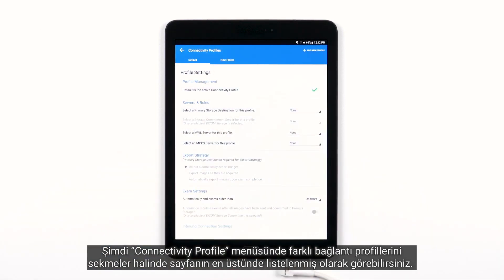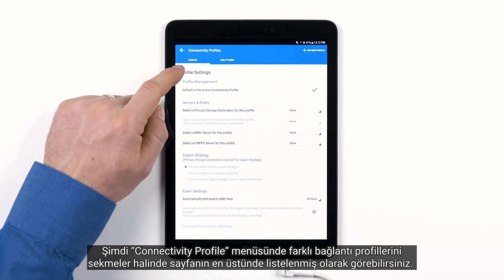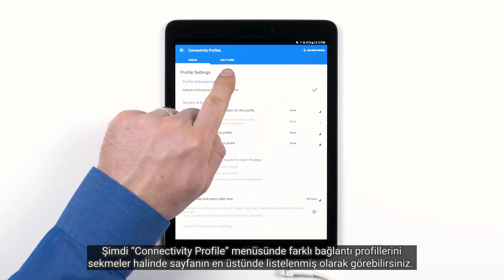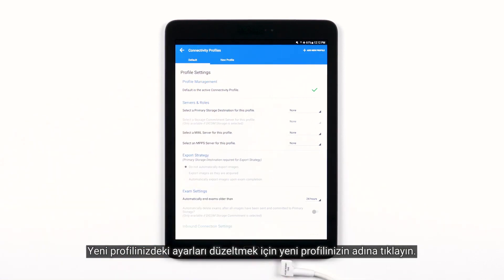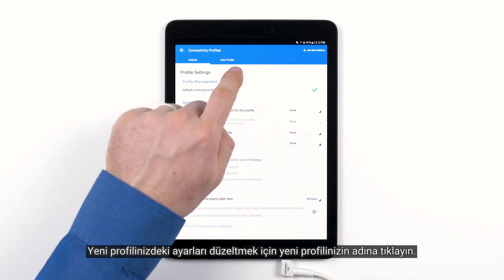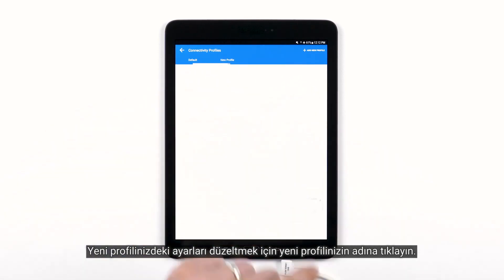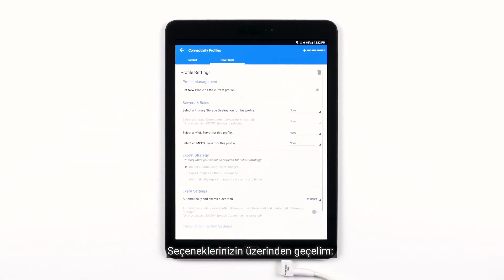Now in the Connectivity Profile menu, you'll see the different connectivity profiles listed on the top of the page in the form of tabs. To adjust the settings in your new profile, tap the name of your new profile. Let's go over your options.